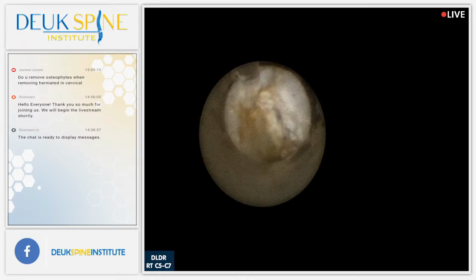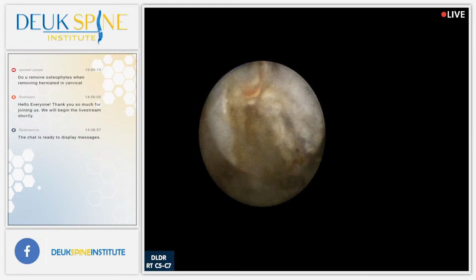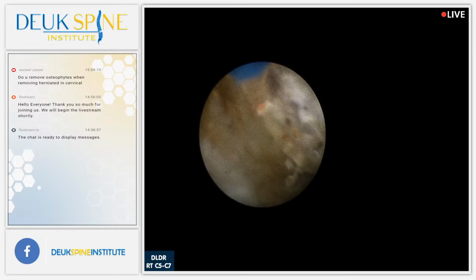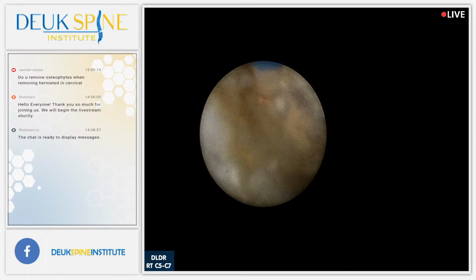So what this indicates is a lot of inflammation happening back here. Remember, this is C5-6. There's a piece of herniation there. More osteophytes there. This is all osteophytes I'm taking away.